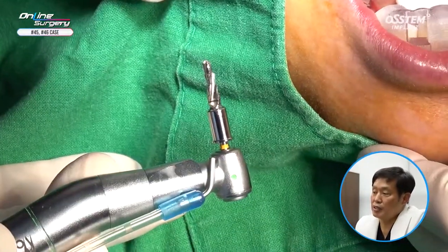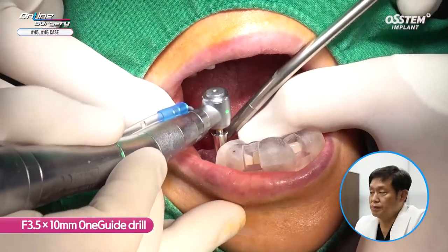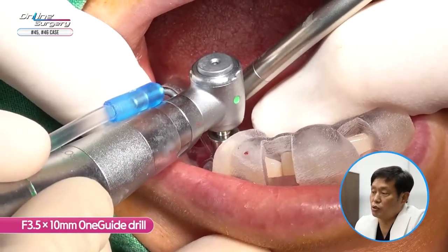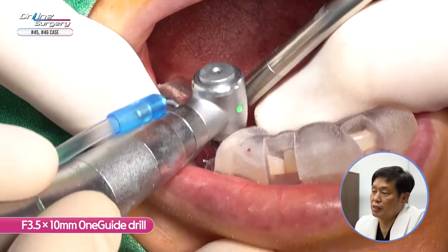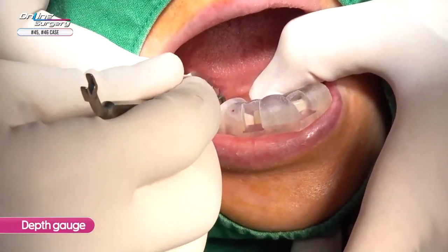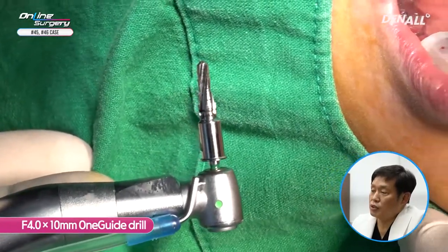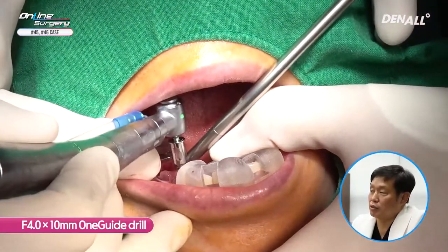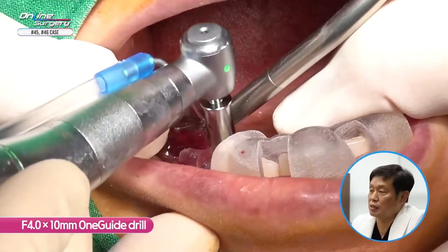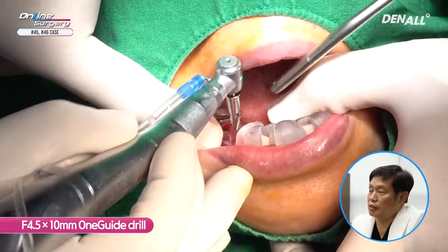A 3.5 by 10 mm OneGuide drill was used. Drilling was done with pumping action to minimize heat generation. A depth gauge was used to check the site. I used the 4.0 by 10 mm guided drill first rather than skipping to 4.5, because of the bone graft. The final drill was the 4.5 by 10 mm OneGuide drill.